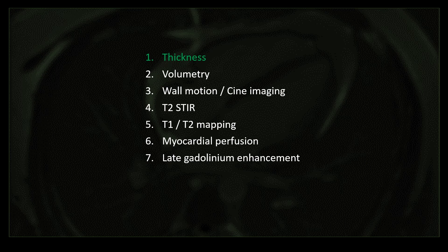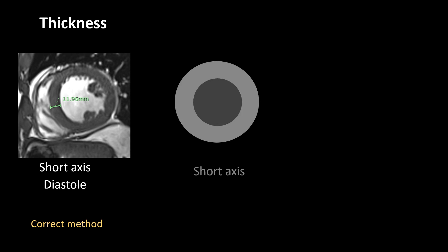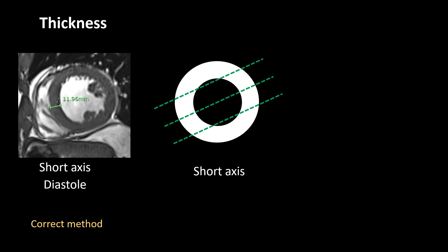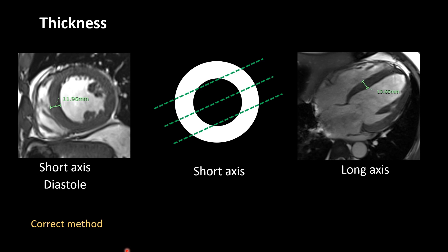First, coming to thickness of the myocardium. This is how thickness should be measured in short axis and in diastole. When we take oblique sections of the myocardium of the left ventricle, we get the four chamber long axis view. If you measure the thickness in these slices, it is not equal across slices, so this is not a very correct method. It is better to measure in short axis view.